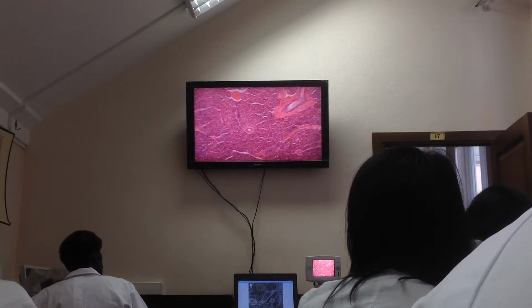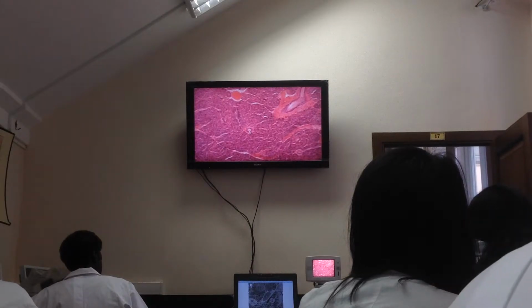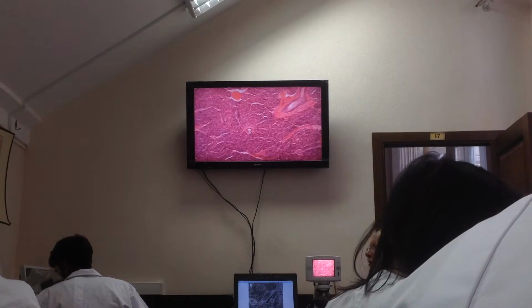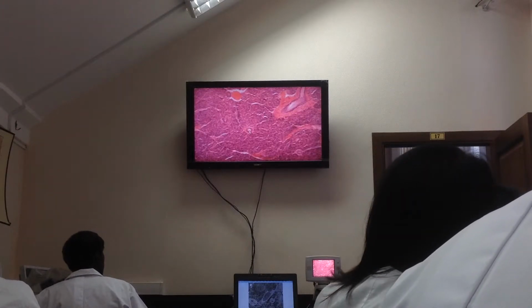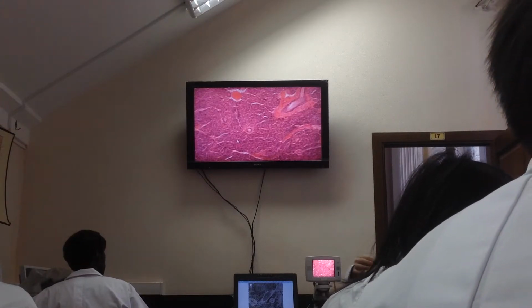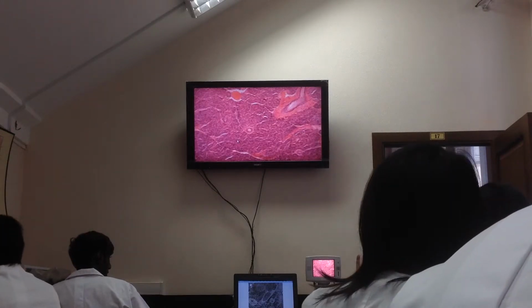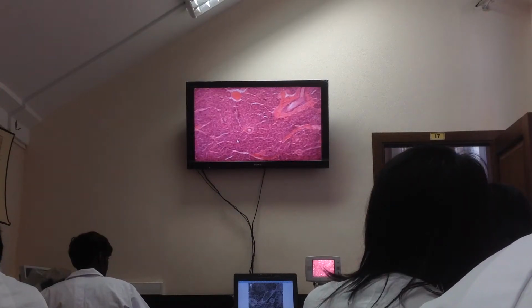Oh, look here. You see a lobule, a part of the lobule. And what is this duct? Where is this duct situated? In the lobule, so it's intralobular. What intralobular? Intercalated or interacinar? Intercalated is small. Be sure you will not find intercalated ducts. You can find centroacinous cells, but the duct is so thin that you cannot differentiate it. If you found centroacinous cells, be sure you found an intercalated duct. But bigger intralobular ducts may be visible. This one.